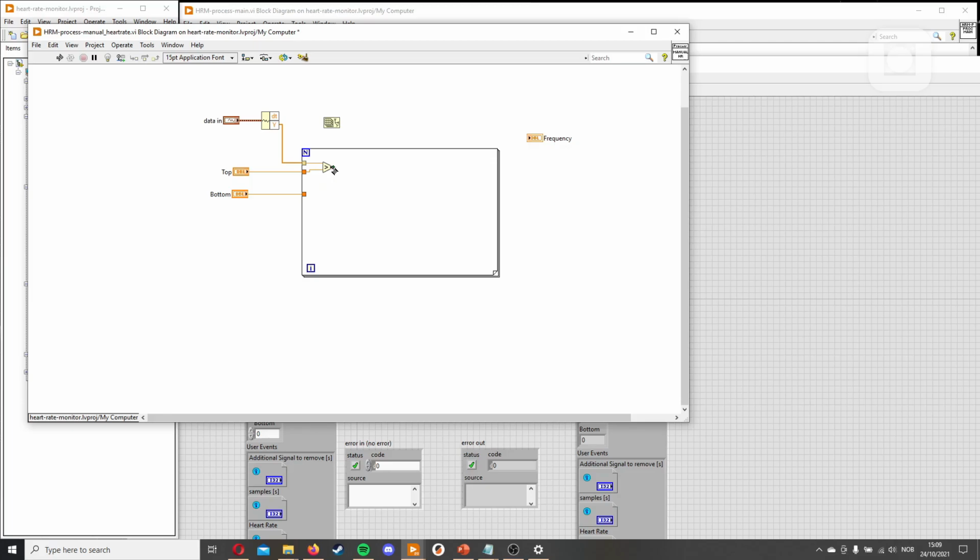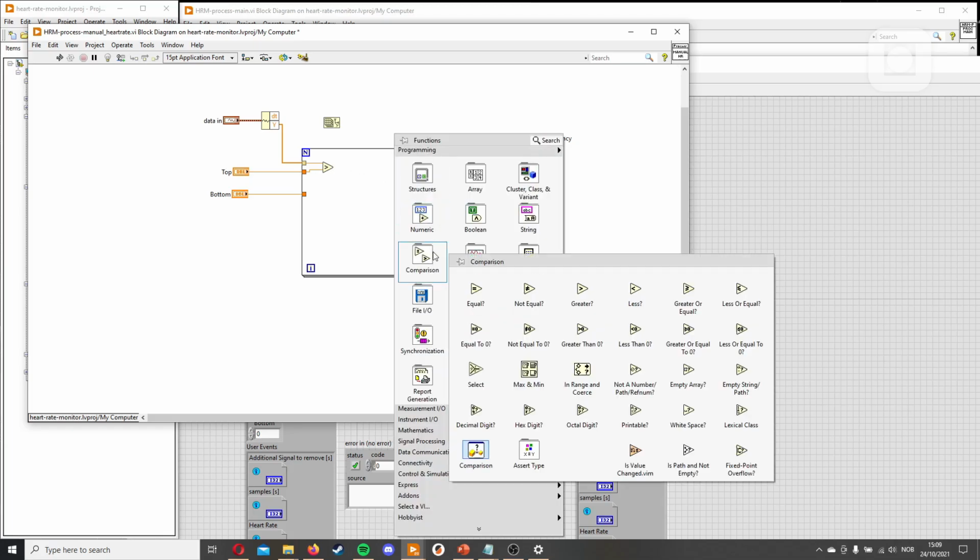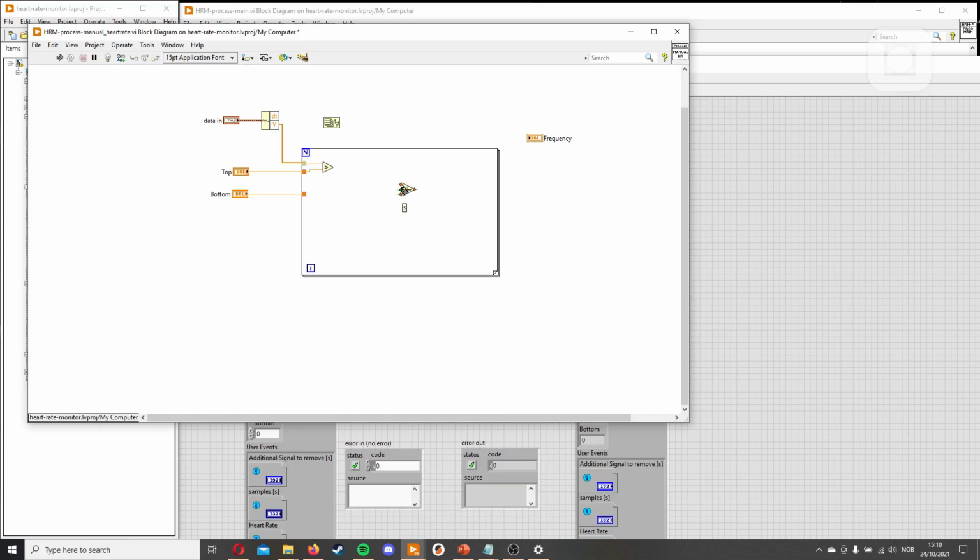So what we need to do is make this set some sort of flag. And we can do this by placing the output here when it's bigger, in here, which will set a flag high. And then we add the shift register that keeps this value up. And we can say it starts with this value at low. And now every time this passes over, it sets this to high, but it has no way of restarting it. So for every set of samples, we'll only get one heartbeat, which would be wrong.